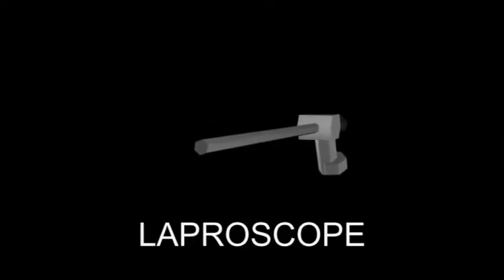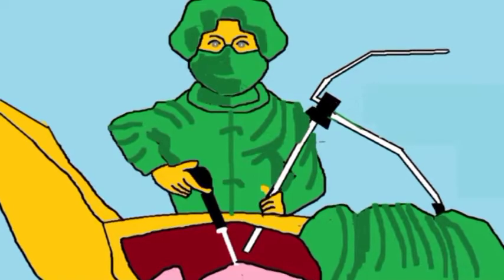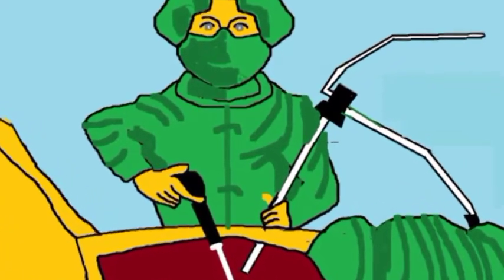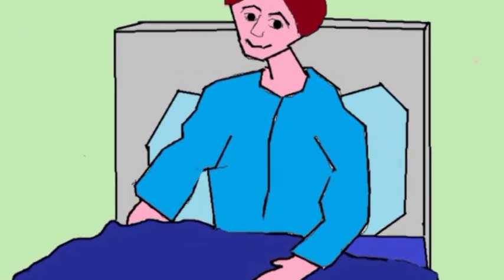With the beginning of the use of the laparoscope in 1970, a breakthrough in surgery and investigation procedures occurred. Though it was rather tricky for surgeons to master the laparoscope, it was good for patients in many ways. But soon it became clear that laparoscopic intervention was not free from complications and limitations.